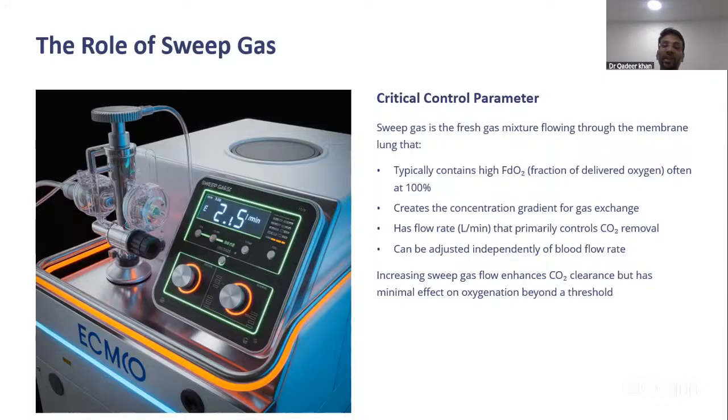Patients who have respiratory failure and initially have high CO2, if the CO2 is brought down drastically, may have devastating biological outcomes. So the sweep gas should be adjusted such that blood flow and sweep gas are maintained at 1:1, and the rate of CO2 reduction should be at most 15 mmHg per hour. If the patient has a CO2 of more than 120 on ABG, or not recordable, you cannot bring it back quickly as CO2 is highly diffusible.